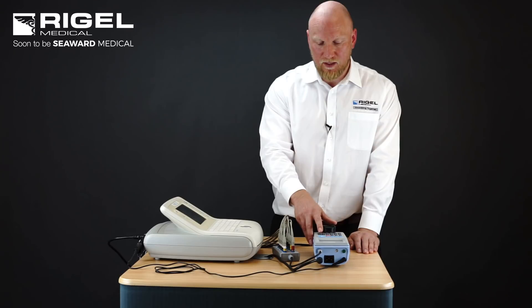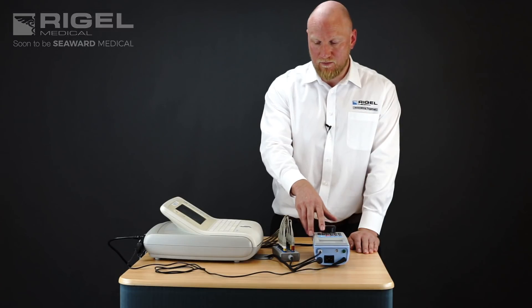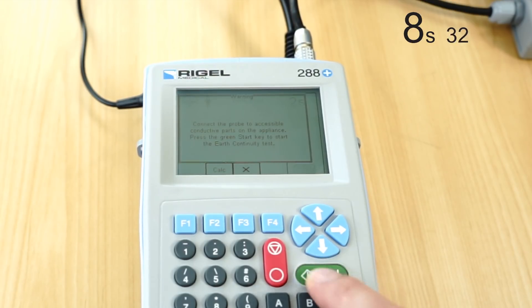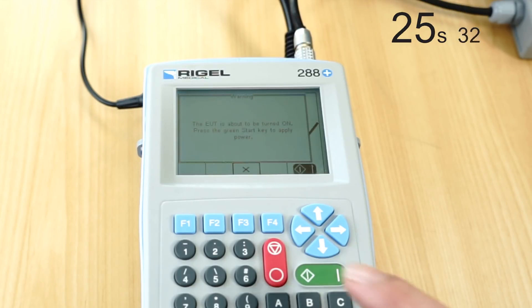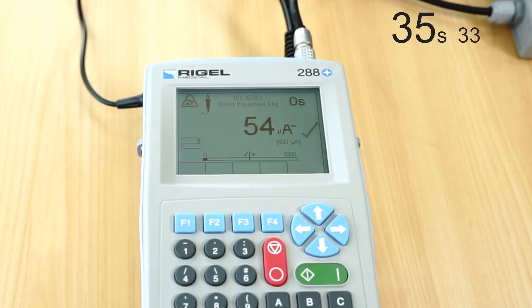Once we're satisfied with our test setup, we're going to prompt the start of the test, make sure everything is connected, and follow the prompts on the 288 device. After the earth bond, we do a load test which is a functional test, followed by the Direct Equipment Leakage Test, followed by a Direct AP Applied Part Leakage Test.